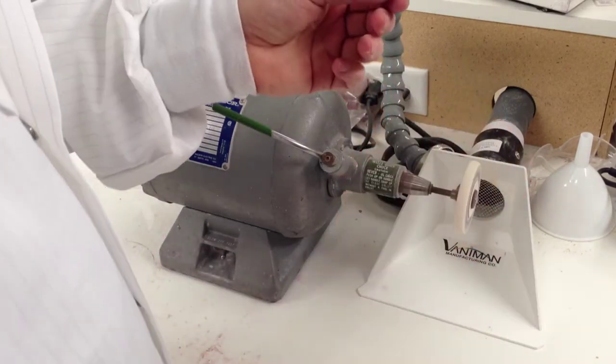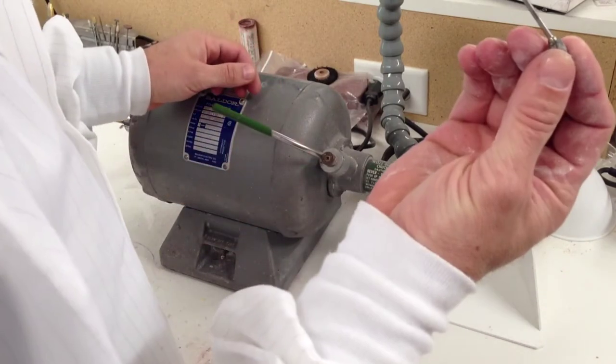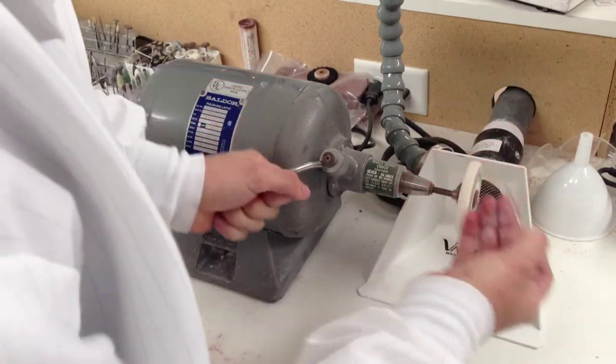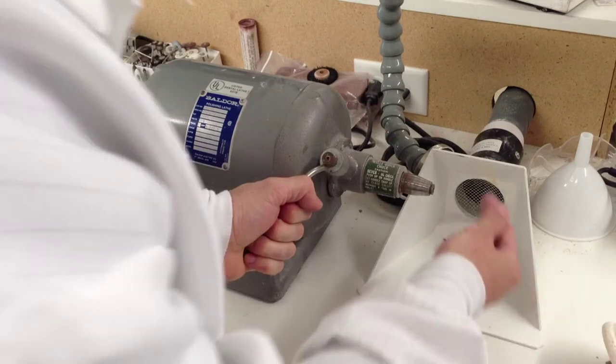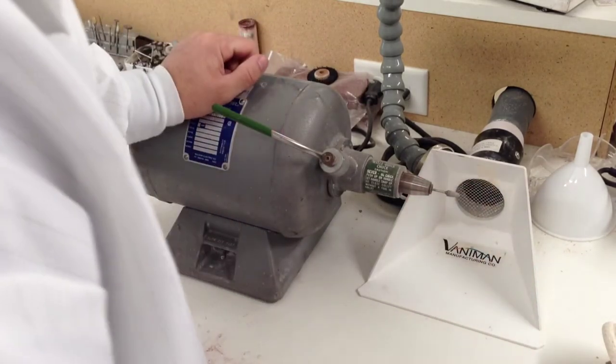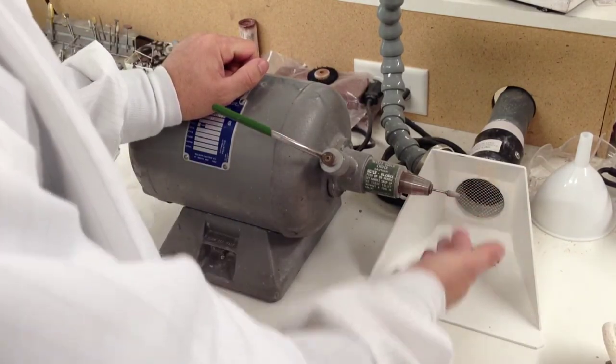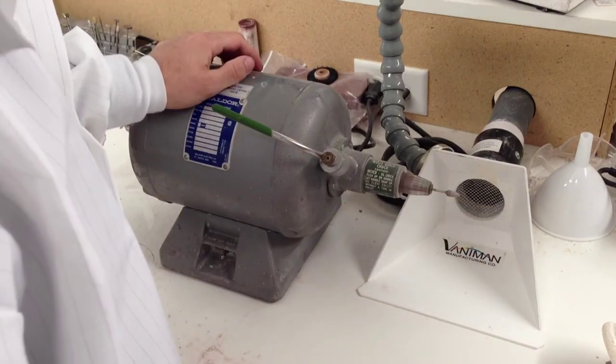The good thing about these quick chucks is they can also receive the standard type burr with a smaller shank, the 3/32 shank. You can stop it, place it in, and use it as you would a handpiece if you need a smaller burr.